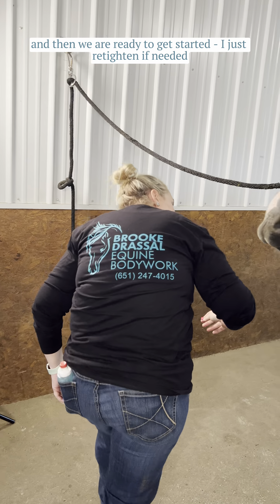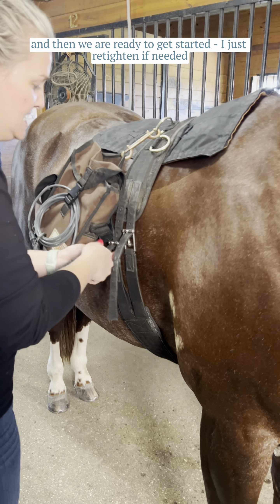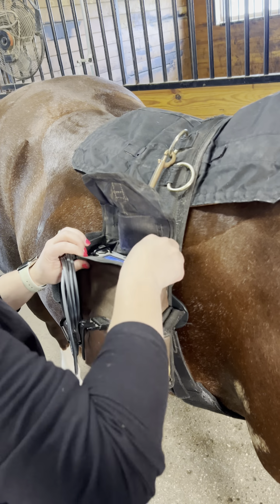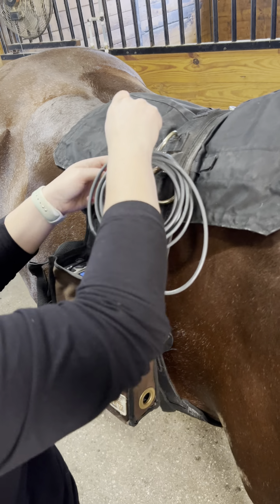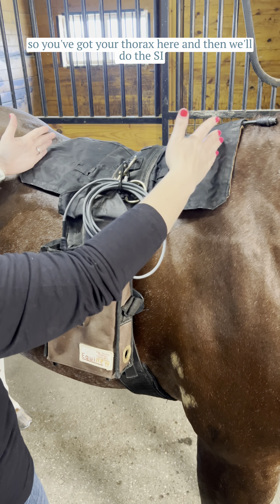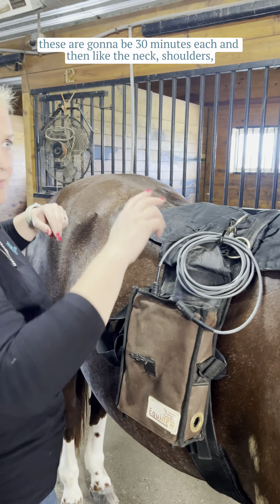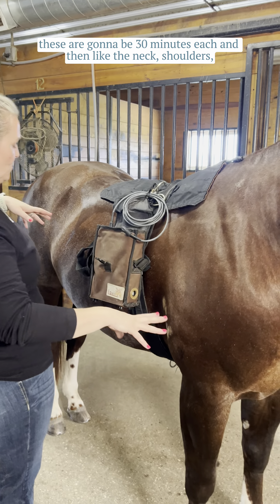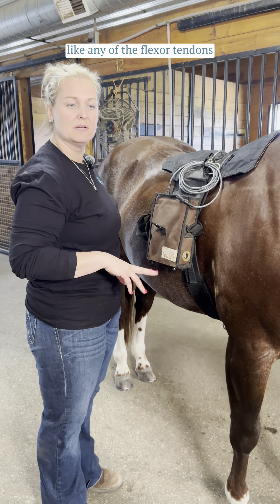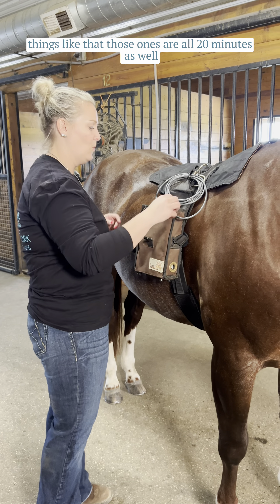I just re-tighten if needed, and then we are ready to get started. For the back, you've got your thorax and then we'll do the SI — those are going to be 30 minutes each. Then the neck, shoulders, hip flexors, those sorts of things are 20 minutes, along with the legs, like any of the flexor tendons — those ones are all 20 minutes as well.